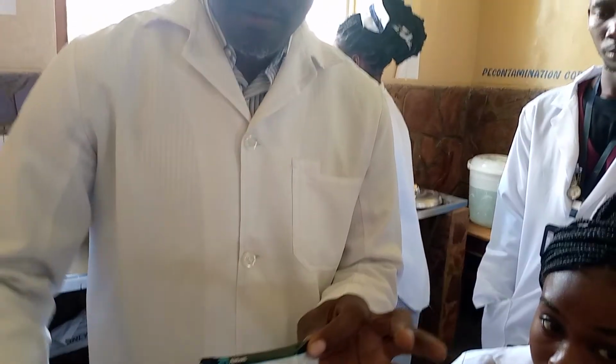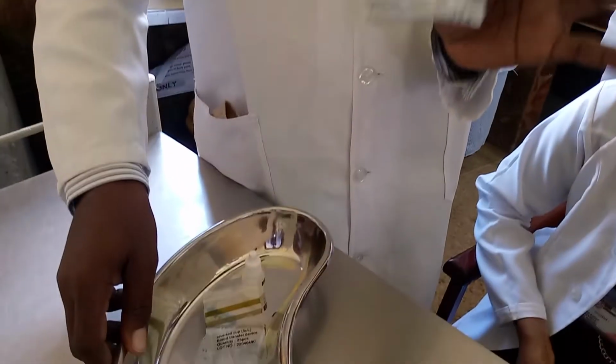Today we want to look at rapid diagnostic testing. We've got a variety of tests you can do. We want to look now at rapid diagnostic testing for malaria. We have this testing kit here so that we show you how to use it.